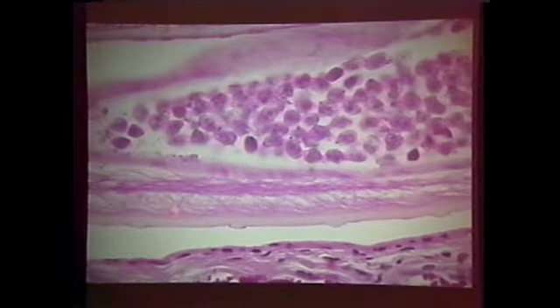But look, here it is again. This is the other worm. You see how there's one stria between the annulations. Look at this. Beautiful. Here's one. There's one under there, one under there. Now you say, well, you're kind of getting picky. Well, you need to be picky because the species of the Onchocerca is determined by the number of striae between the annular rings.